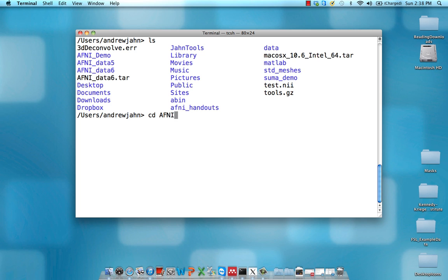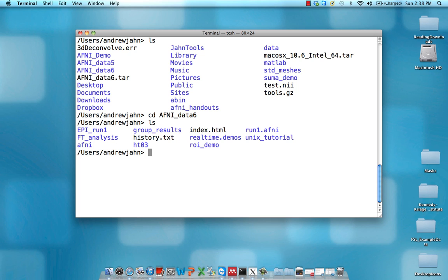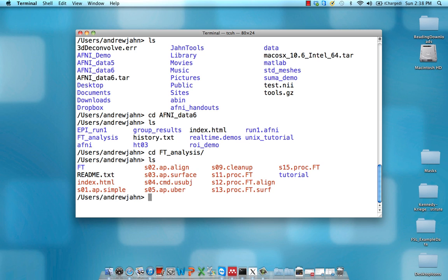Here I've downloaded AFNI_data6 to my home directory. So I'm going to cd into there and ls to see what's in there. Most of the data we'll be working with is in this ft_analysis directory. If we go in there, we see that we have this ft directory which has the actual raw data.